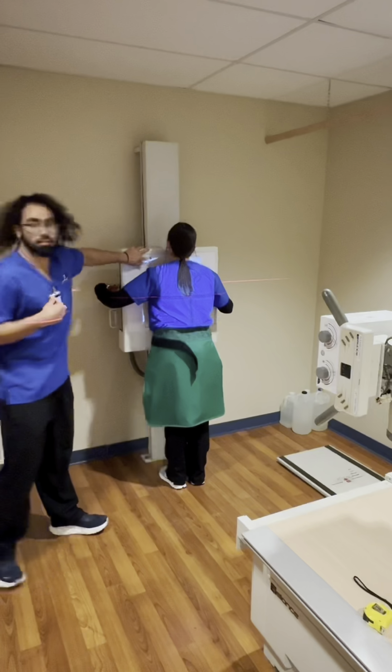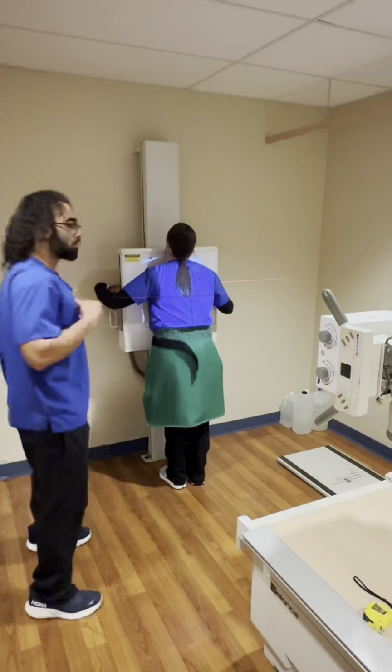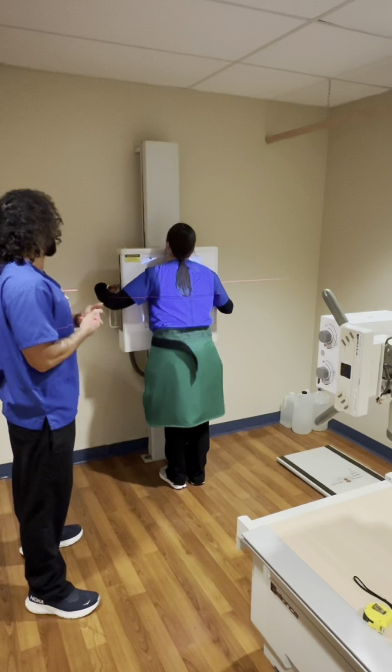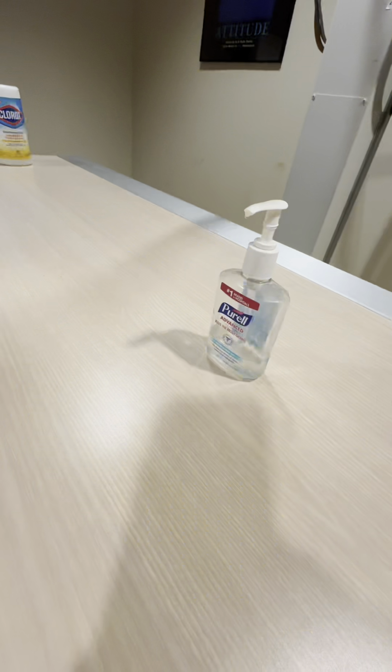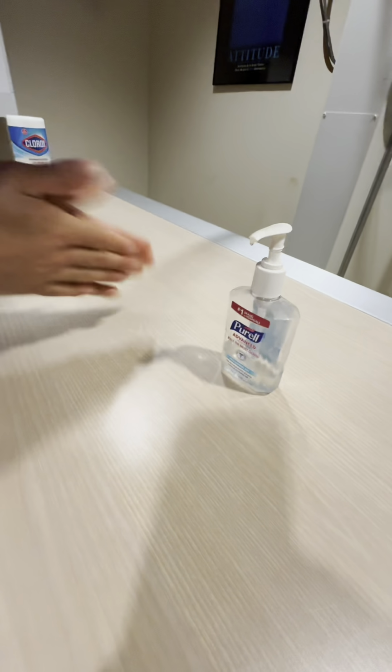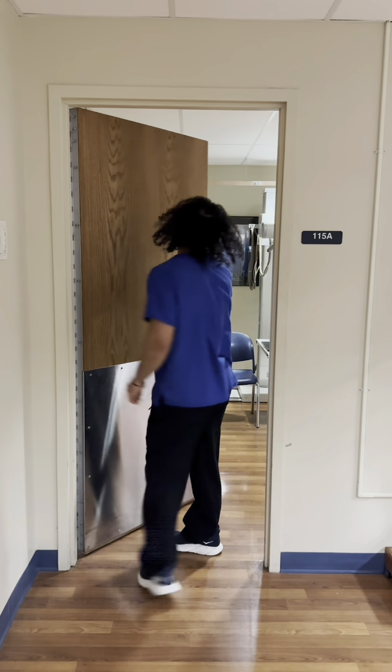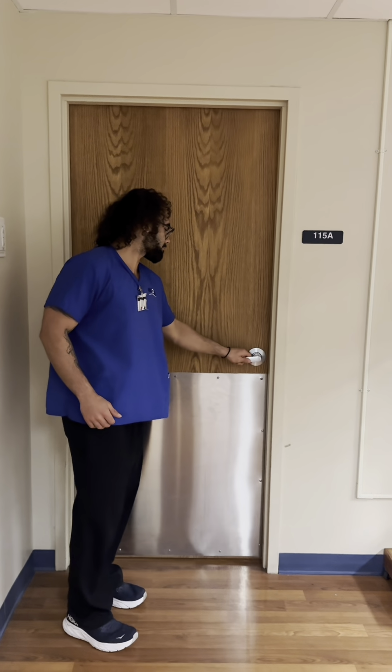Want to put the correct marker on the correct side. And then when I go to take the exposure, you're gonna take a breath in, blow all out. You're gonna take another deeper breath in, and then hold it until I tell you to let go. And before you take your exposure, you're gonna want to shut your lead line door here.